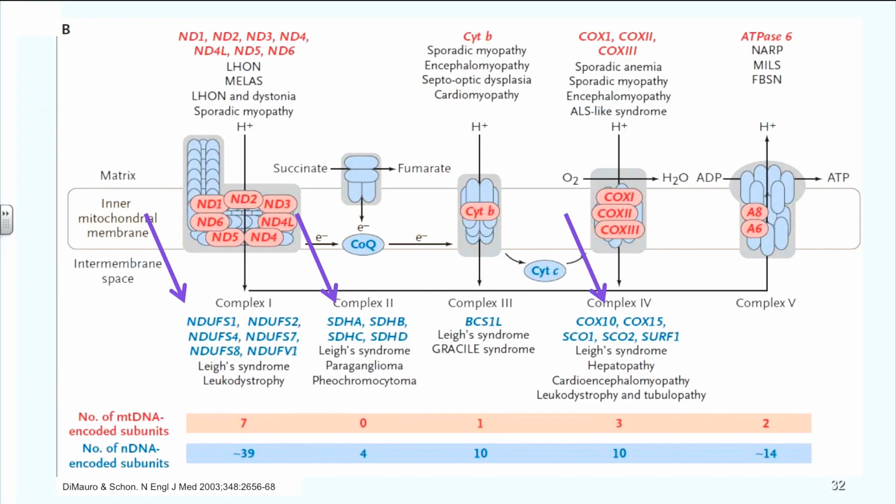Why do we think that SDH is still useful when we have NADH? Or why do we think that we still need cytochrome oxidase if we have the other two? As we said, NADH can be used by other organelles. So if NADH is abnormal on a reaction, we cannot tell for sure whether it belongs to mitochondria or not. Whereas SDH is only used by the mitochondria.